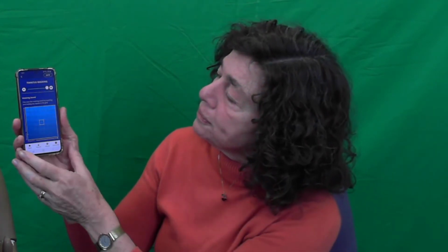Now I'd like to show you how you can customize that tinnitus masking sound using the app. On the home screen, there is a new icon, this ear, and currently you'll see that the volume level for the tinnitus masking is at 0, so it is off. If I move the dot anywhere to the right, the volume increases and the grid becomes available. It is set up much like our sound tuning grid, and you use it in the same way.